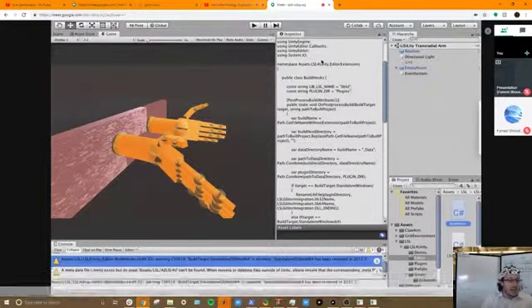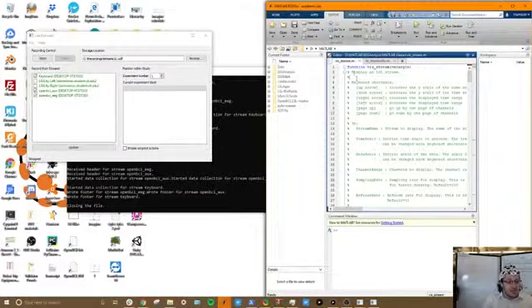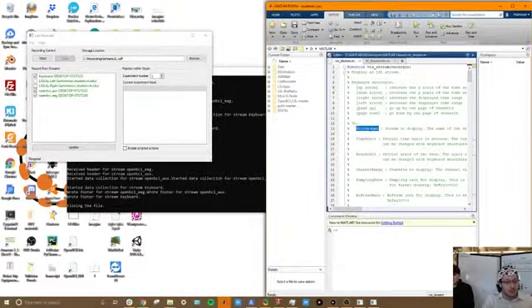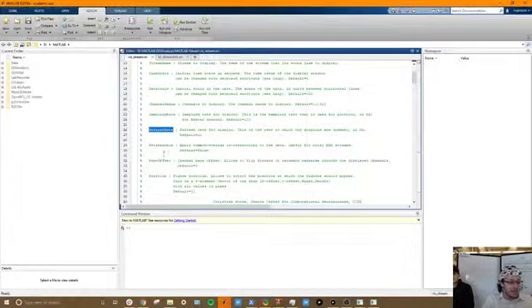But to finish it off, I want to show you one last thing, and this is called VizStream. You can see there's a little bit of code in here that talks about what kind of information you can give to VizStream. You can tell it what stream you want it to look for. You can tell it what the time scaling is. You can tell it the data scale, the channel range, the sampling rate, refresh rate, etc.